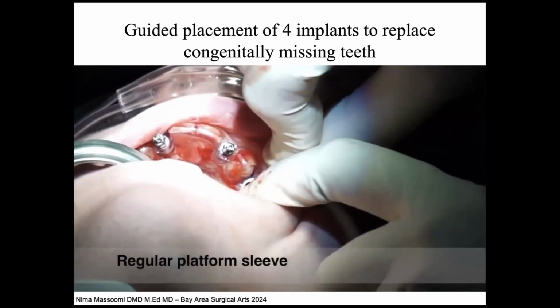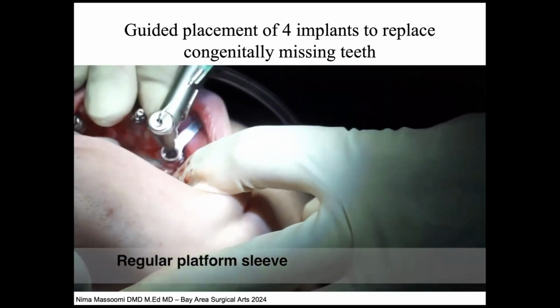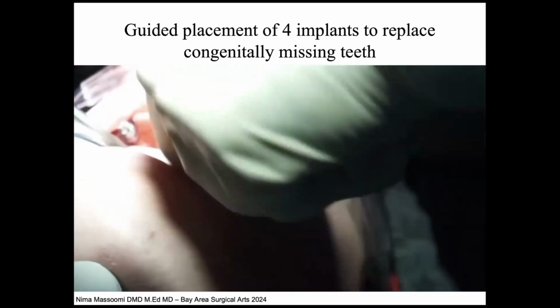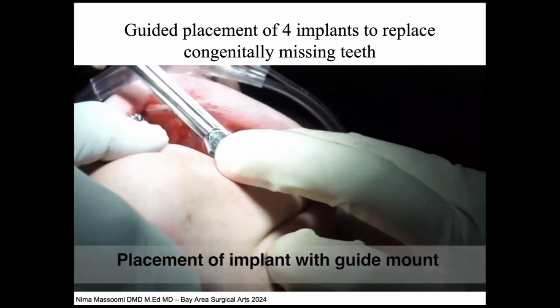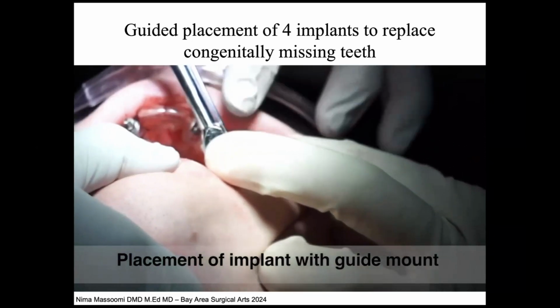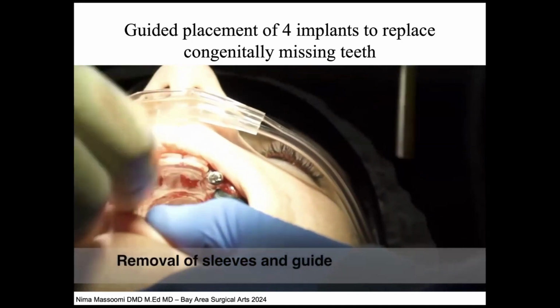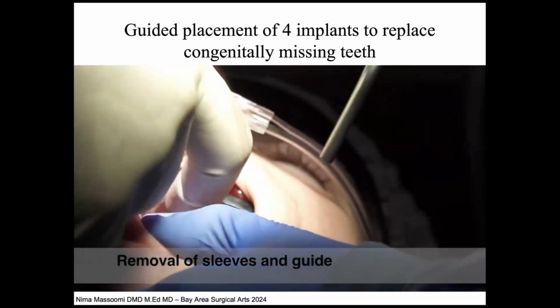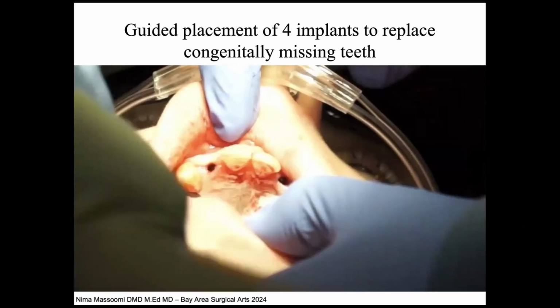So we need to make sure that if we're using a surgical guide, we have a surgical guide kit. Okay. And you can kind of see that we fly through, and I don't work this fast. We sped up the video just so you can see how we do this. But the Nobel Biocare system has their surgical guide kit. They have the mounts and all that stuff that we use to place the implants using the surgical guide.